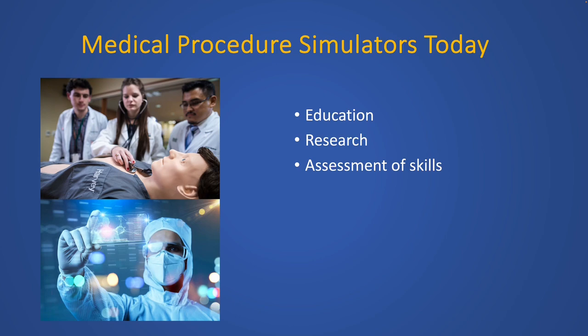Less common is their use for research, or less common knowledge, I should say. Simulators aid in the development of new devices and medical procedures. Researchers can now test prototypes before clinical implementation and in a controlled setting.